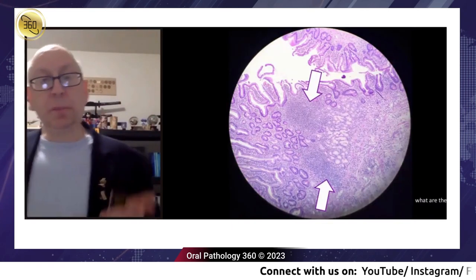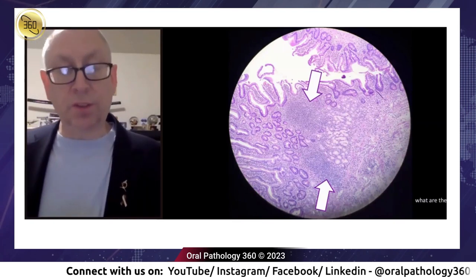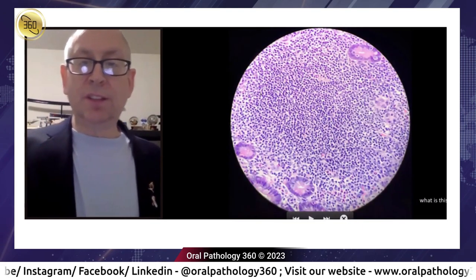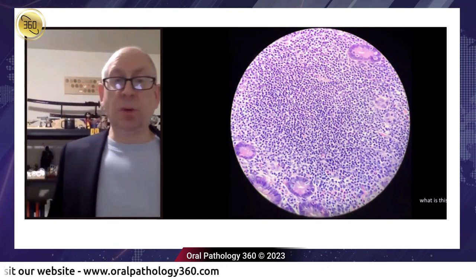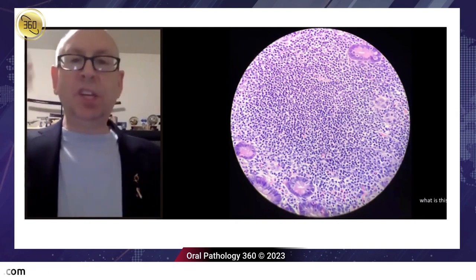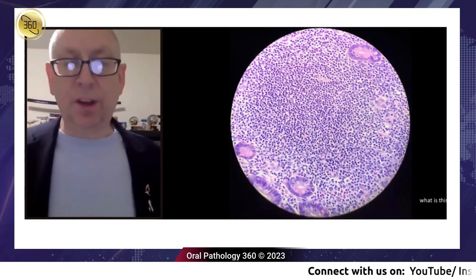Now this is a patient who has neurofibromatosis. So we're going to see they get neuroendocrine tumors, as it turns out. There's some surprises here. The second thing is to realize, what is this? This is lymphoid tissue, right? So guess what? You have Peyer's patches and lymphoid tissue. I'm just showing you normal anatomic features of the GI. I actually teach that the GI is just an extension of the oral cavity. It starts here and it goes to the other end.